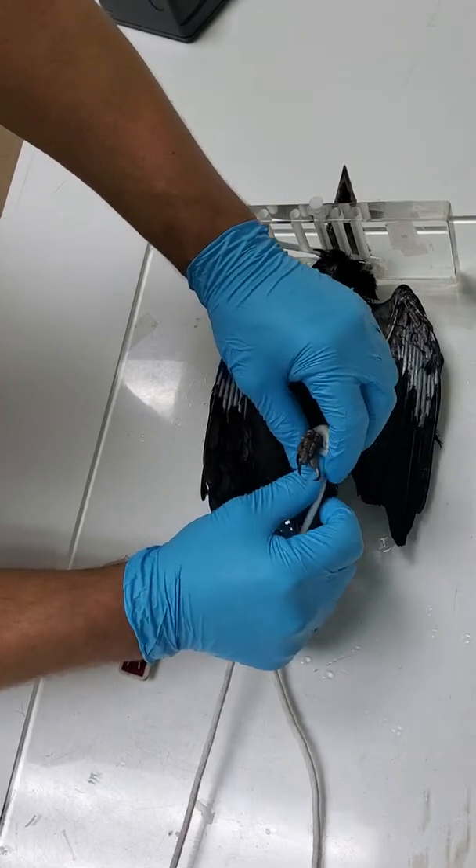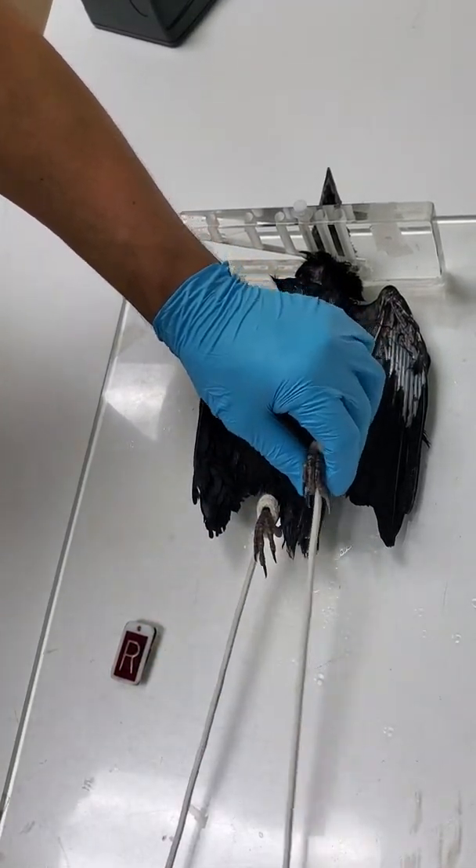If this was a bird of prey, we would normally wrap the claws — the talons — in vet wrap.